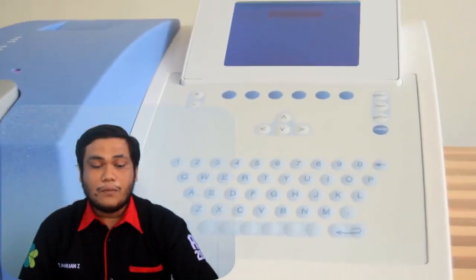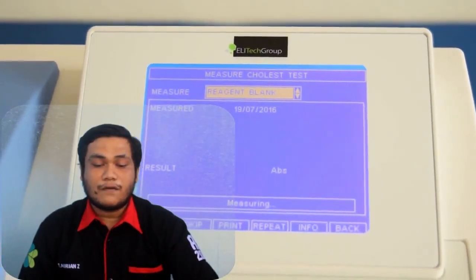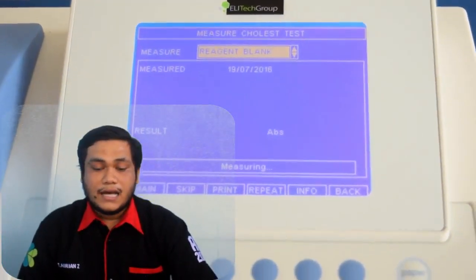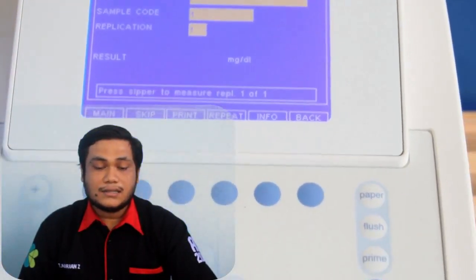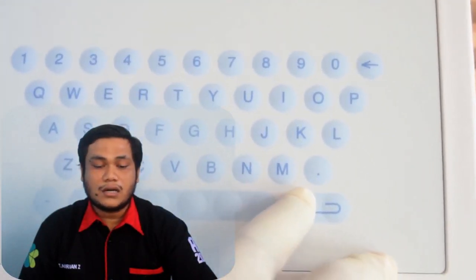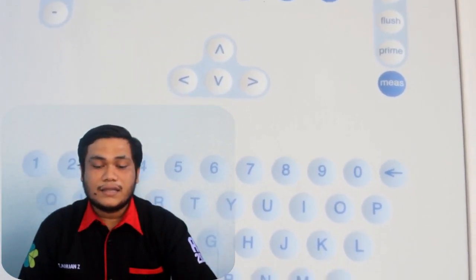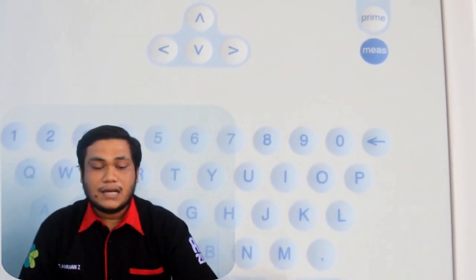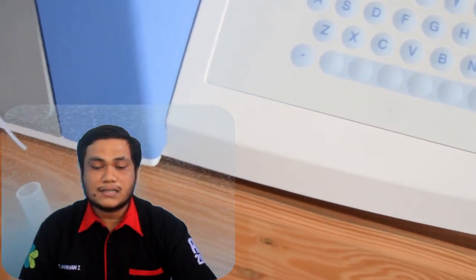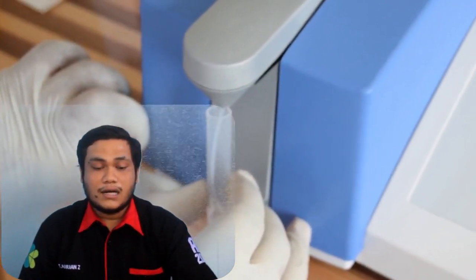Number 4. Open the blue cover. Open the cover from the front, then the back. If required, pull the paper from the slot. Step number 5. Open the screw with the plus screwdriver slowly. Then open the metallic cover. Number 6. If you only want to adjust the lamp, open screw X with the small plus screwdriver slowly. Don't let go.